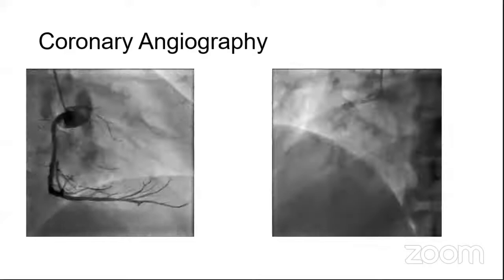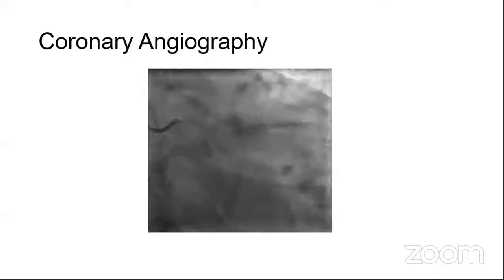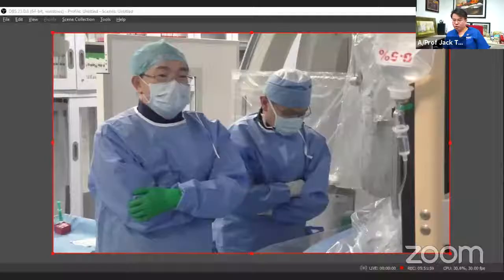But nonetheless, yesterday the decision was to have a further discussion with him, and give him the opportunity to consider bypass grafting as an option instead of left main PCI. So after some discussion yesterday with him and the family, he has opted to proceed with PCI, and that's why he's here today, just in time, if you like, for our demonstration. So that's the case.